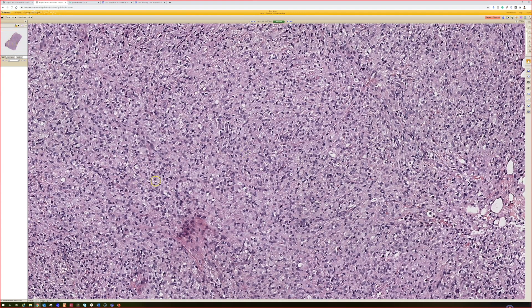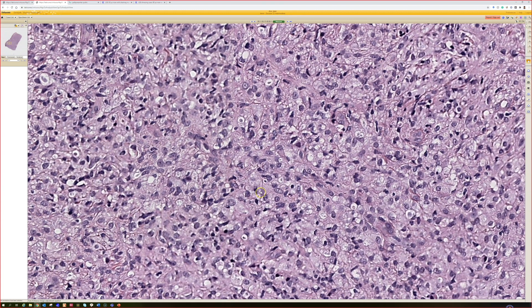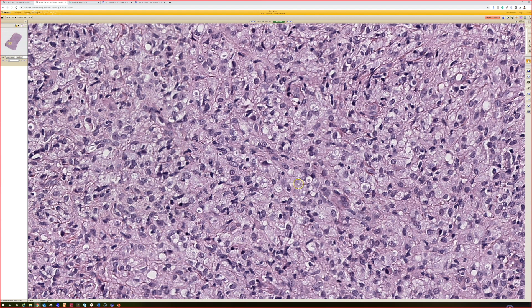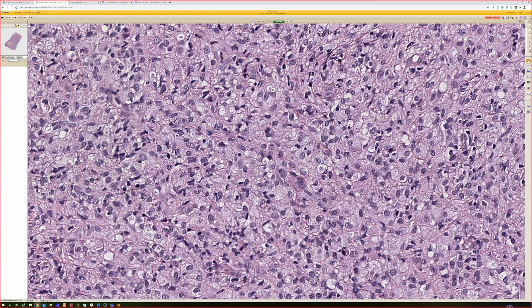And what kind of cells mostly would you say these are? Histiocytes, right. When you get even a little bit closer you can see that their cytoplasm has kind of some — very good — this is sheets of histiocytes with a kind of pale frothy, loose-looking cytoplasm.